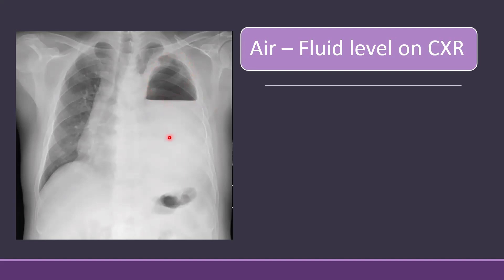Below that line there is a white area. This line separates an area of air and fluid — due to low density, air rises to the top and fluid settles at the bottom. This type of finding is only possible when there is both air and fluid in the thoracic cavity, and this air and fluid can be inside the lung or outside the lung as well.